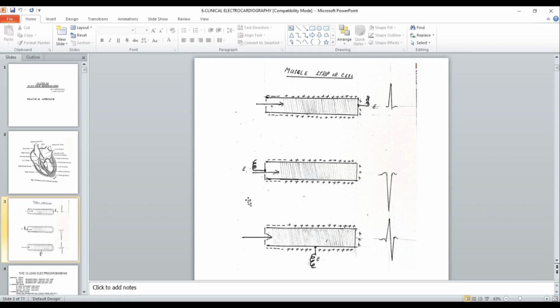The electric impulse, while passing through the cells, has an amplitude and a direction, and therefore it is known as a vector. Millions of vectors pass through the heart and converge towards the main bulk of the heart. The mean of these vectors is known as the axis of the heart.